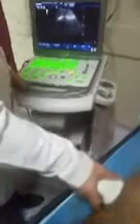So I put my probe in the line of the mid-axillary line, in the coronal oblique plane. When I put my probe at the mid-axillary line with the coronal oblique plane, you see the probe marker.